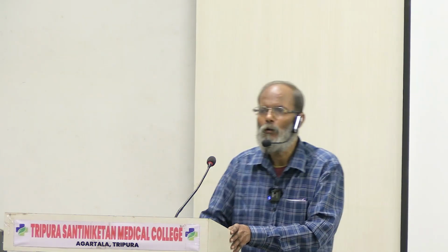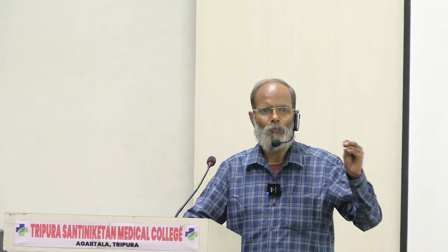This test is done to prove or disprove whether a lady is sterile or not. That is, through this test, we can see whether the dye is passing from the uterine cavity to the spillage in the pelvic cavity. Right? So, this is called hysterosalpingography, and the dye given is lipoidol, 6 ml is enough.